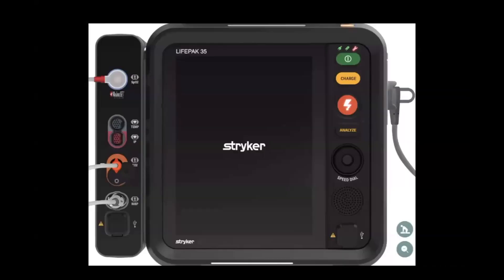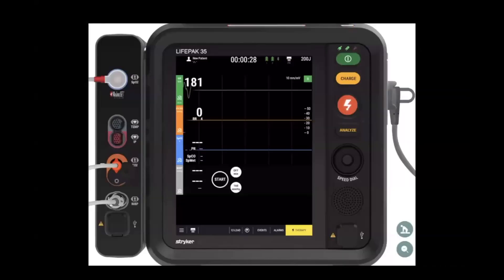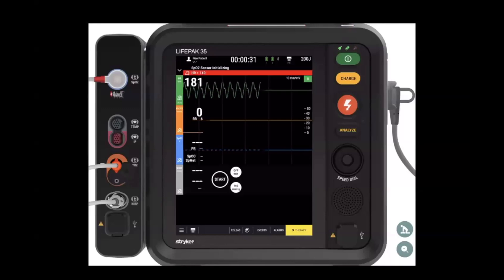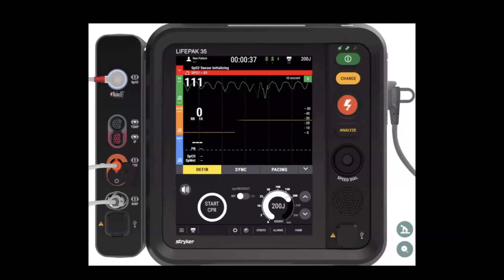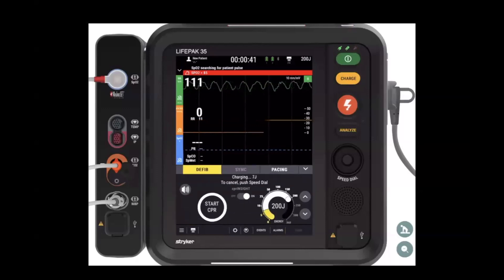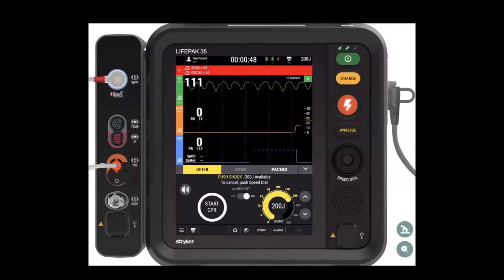The one we hear regularly is: what about VTAC? Well, here's an example of VTAC, and I want you to think about some of the other things. This is newer technology — everybody always wants to affix on the one-offs. We get VTAC without a pulse — what do we do? Normal things: we shock it.